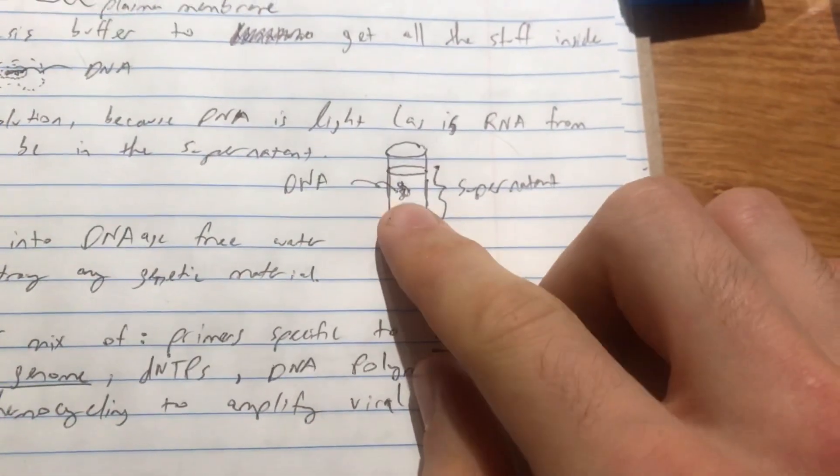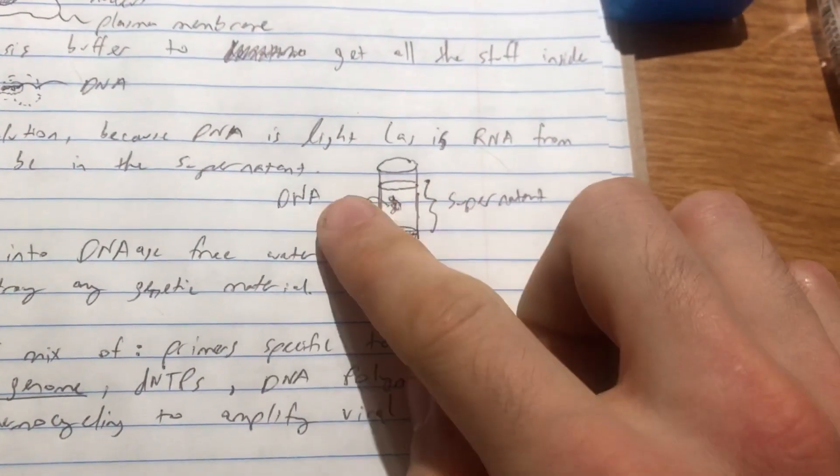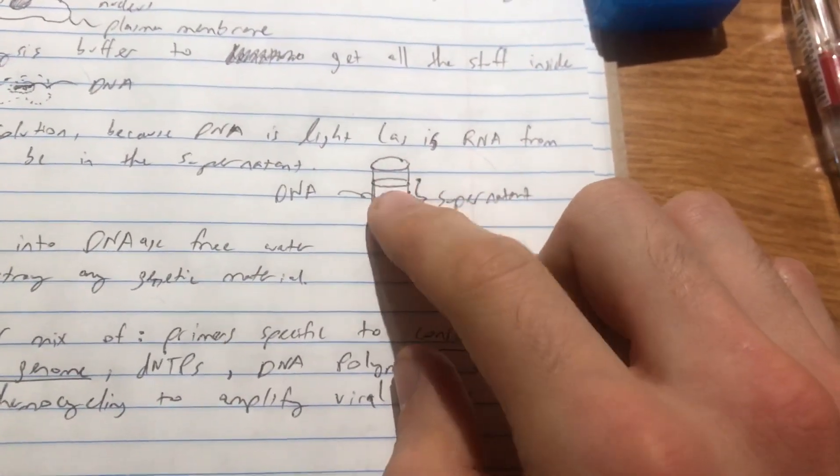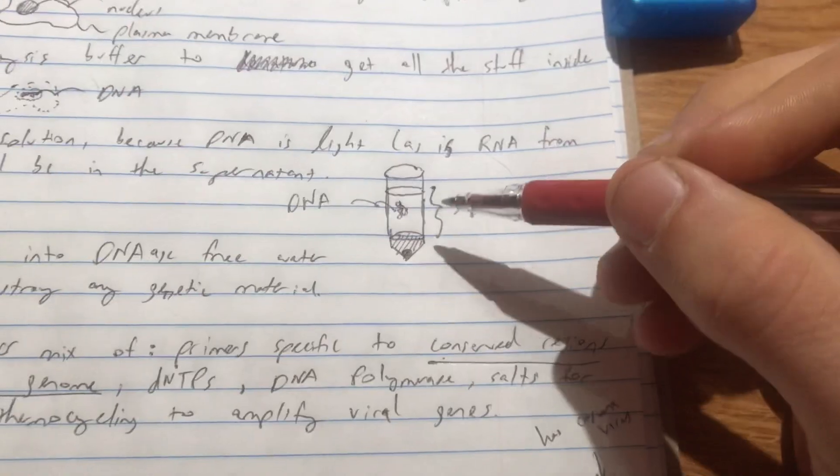So after we've centrifuged it, we do have in your supernatant the DNA as well as the RNA. And so all the genetic material that we care about is in this top part of the tube.